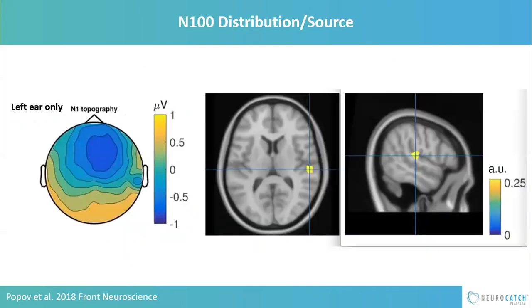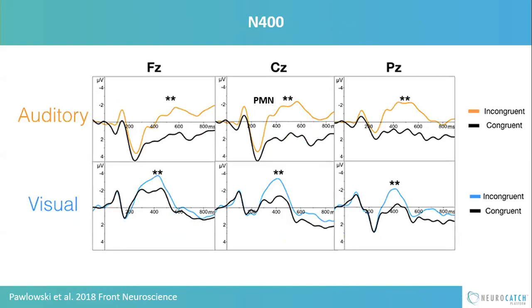Okay, so let's do this again. Oh, back up. Quickly, walk yourself through the N400. Start again: the auditory is the NeuroCatch sequence as you know it. Look here, you can see the P1, the N1, the P3 or P2, it's difficult to say in that. And then you can see the strong, broad peak of the N400.